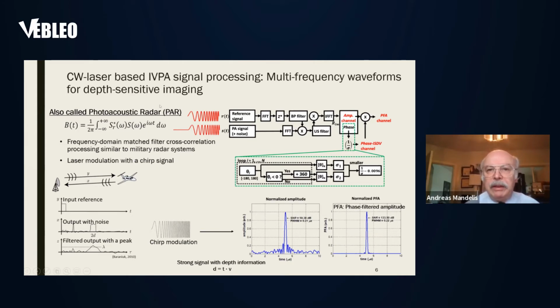So a radar is basically that. It's one that generates a multi-frequency signal. And here is a signal that has multi-frequencies, this black array here. And the response is also multi-frequency, because whatever frequency you're putting in, you're picking up a signal from that frequency. And the way this operates, you're adopting radar principles in the photoacoustic imaging of tissues. This is really the novelty here.